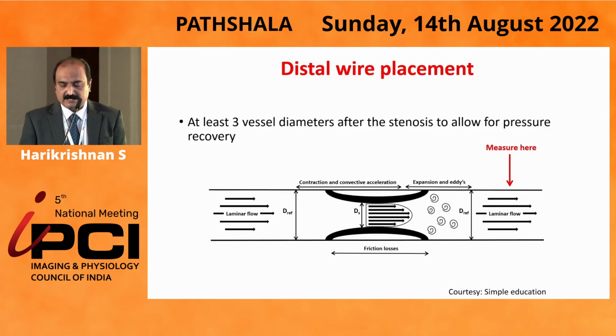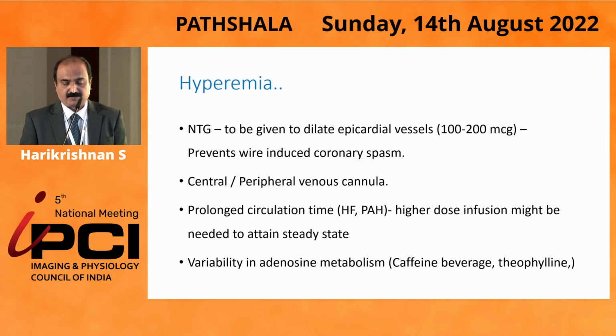Distal wire placement, as again seen, thanks to the slide from Vijay Kumar. There will be pressure recovery just immediately after the lesion, so you have to measure it much distal to that. Hyperemia: nitroglycerin should be given to dilate the epicardial vessels.